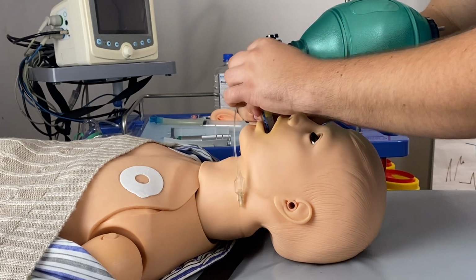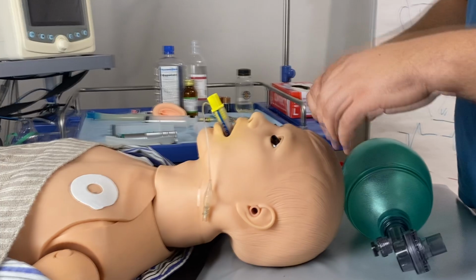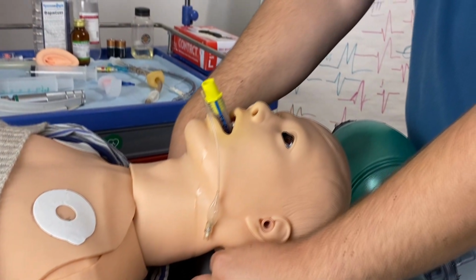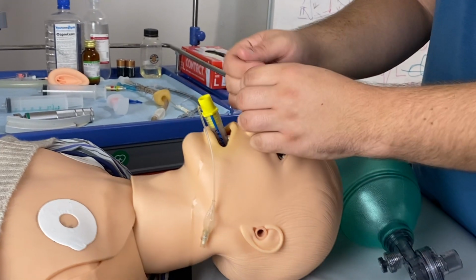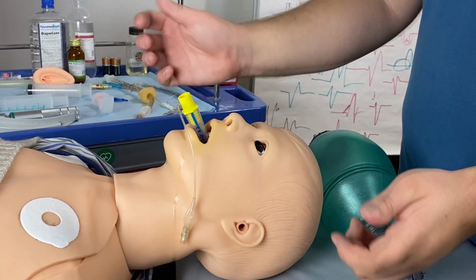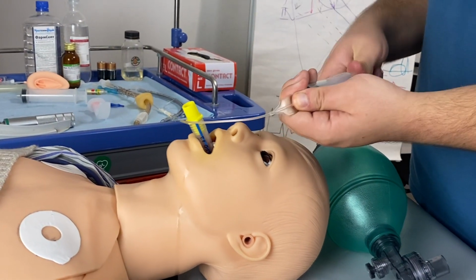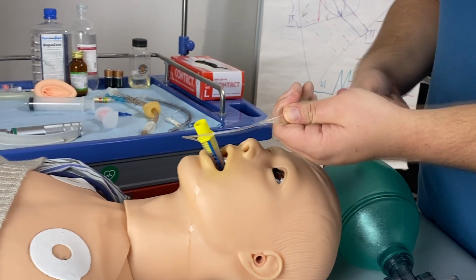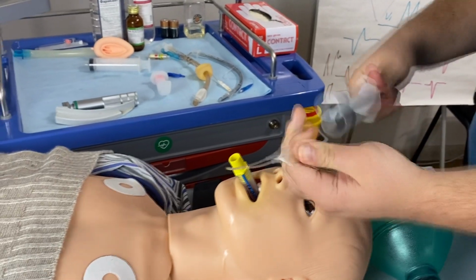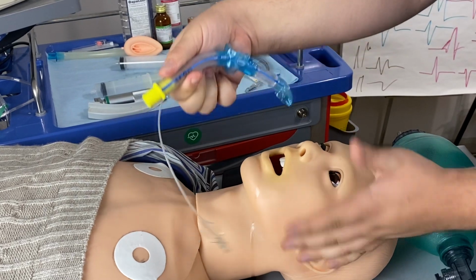For the long stay of these tubes, we have to fix it. There are special fixation devices, but if they are not available, you can just use a normal bandage to strap it around the head and tie here, so it will stay in this position and it will not go anywhere. To remove the device, we have to firstly remove all the air from the cuffs. And then also, without any special maneuvers, we just remove it.